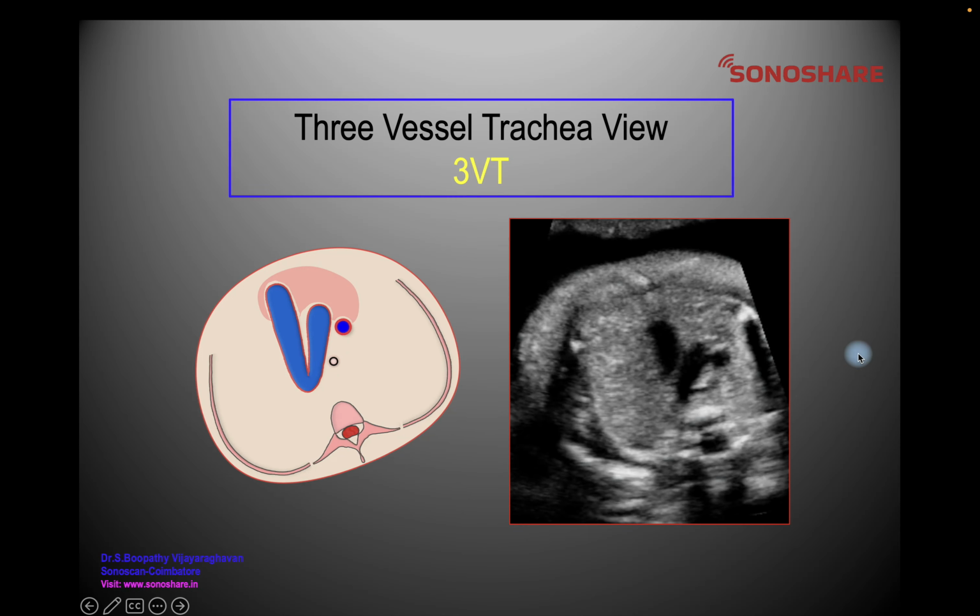Three vessel trachea view, otherwise 3VT view, in fetal echocardiography.